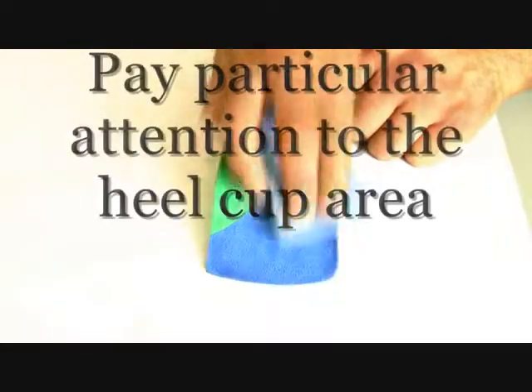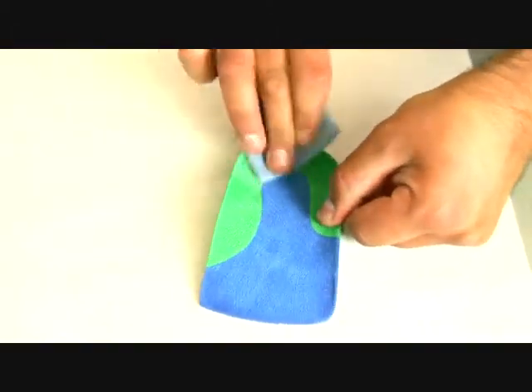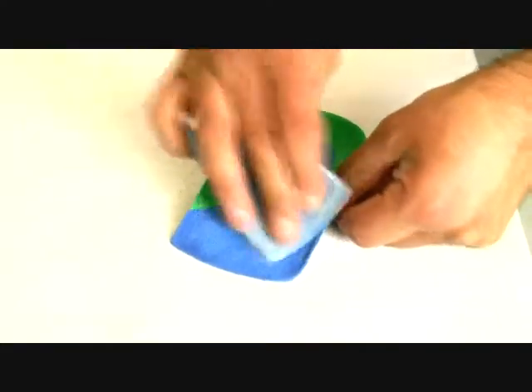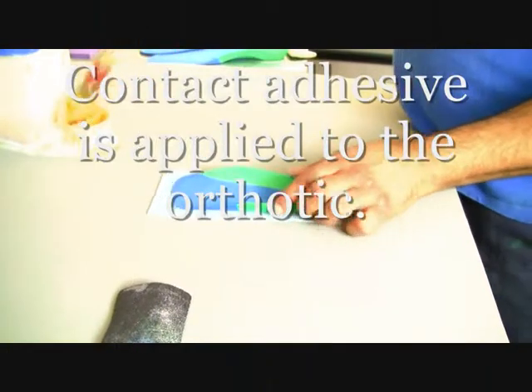Pay particular attention to the heel cup area. This will allow the glue to bond fully to the dorsal surface of the orthotic and so give a good bonding to the cover. We're using double abraded or buffed 1.5mm PPT. The shiny surface is removed to provide better adherence.